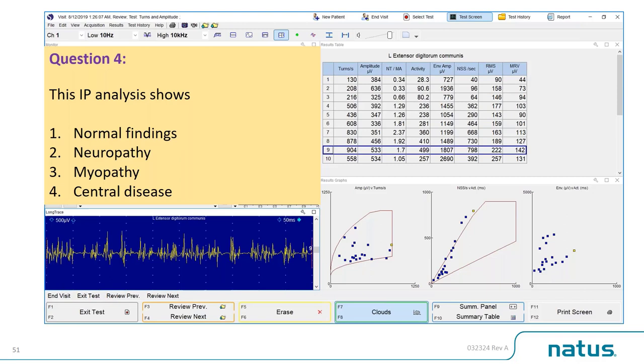This is something that took less than 30 seconds, but when you present this kind of evidence to the referring physician, you will feel more confident, the physician feels more confident, you have more objective data, and therefore, I think it is better patient care.